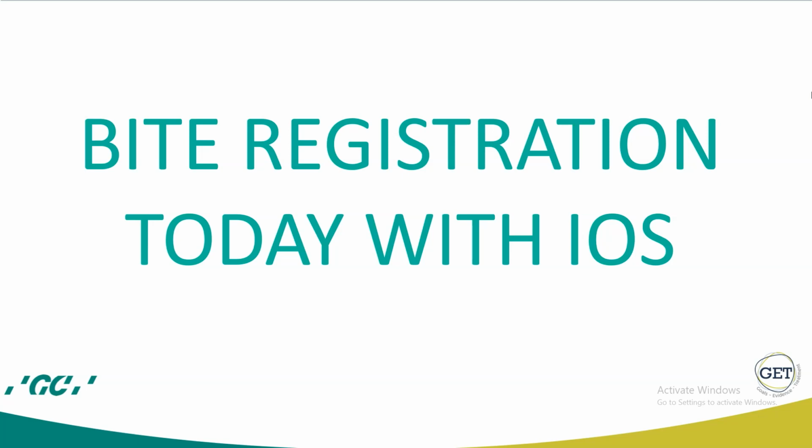Today, digital technology has touched on every aspect of orthodontic treatment. It is now commonplace to perform virtual treatment planning as well as translate the plans into treatment execution with digitally driven appliance manufacture and placement, using various CAD/CAM techniques, from printed models, indirect bonding trays, and custom-made brackets to robotically bent wires. Furthermore, it's also becoming possible to remotely monitor and control treatment.